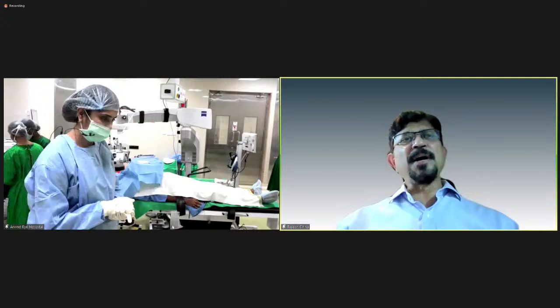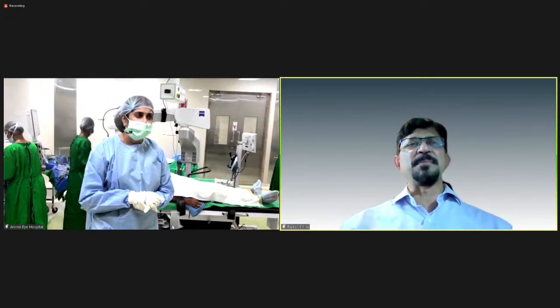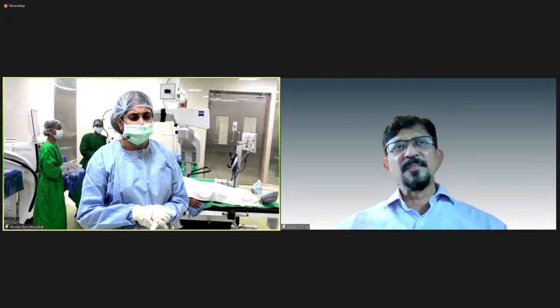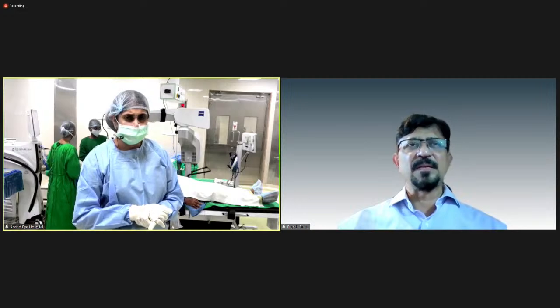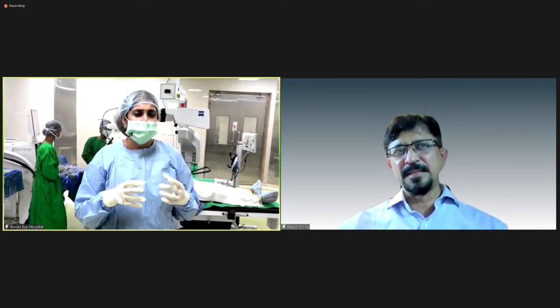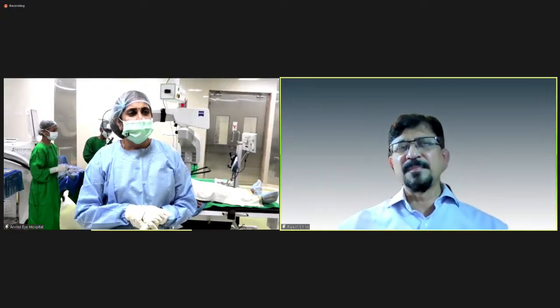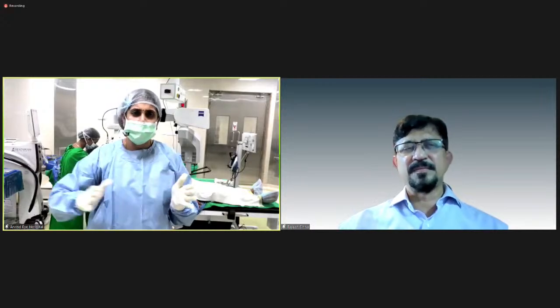In a higher myope, would you like to go for a little lower IOP? In such cases, maybe. Actually, like I said, I don't change it. Even in very high myopes, I don't change it, because I would only if the patient had some discomfort, any pain or any pressure sensation. But I don't see that as an issue. Of course, the machine would permit us to go much lower than this. But I think the machine also permits us to have one setting for a wide range of cases.